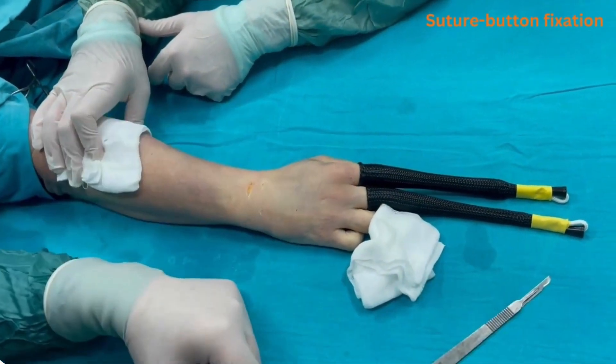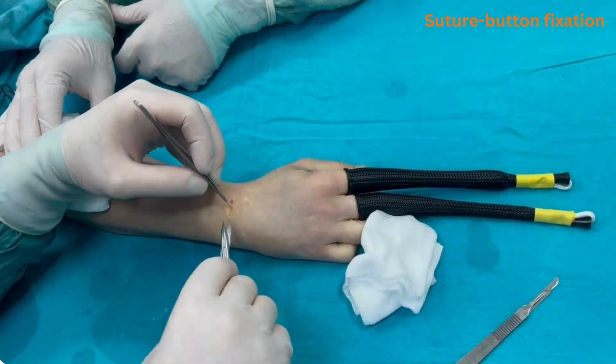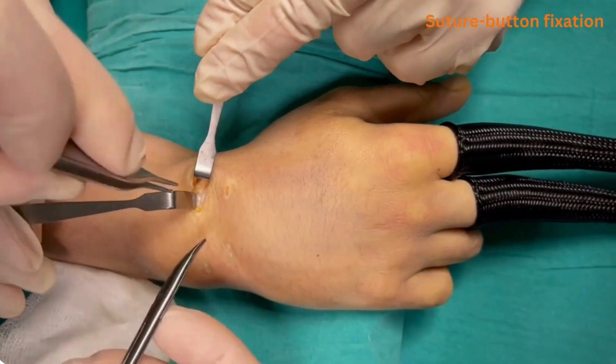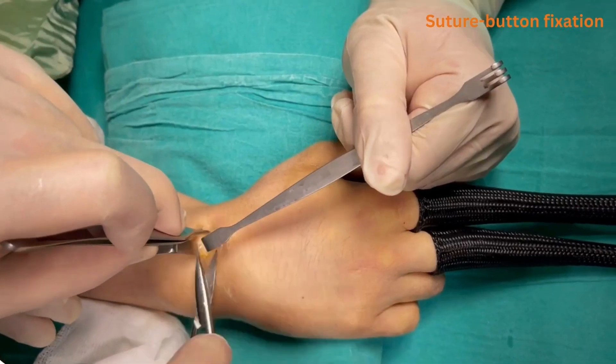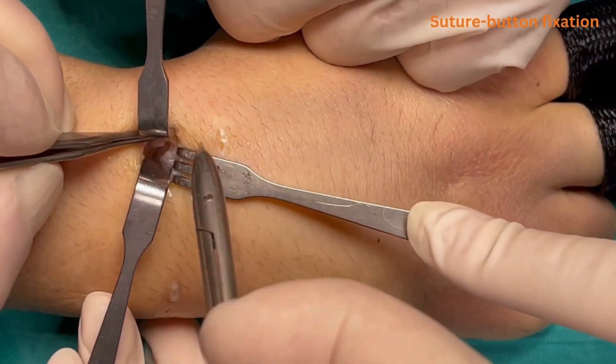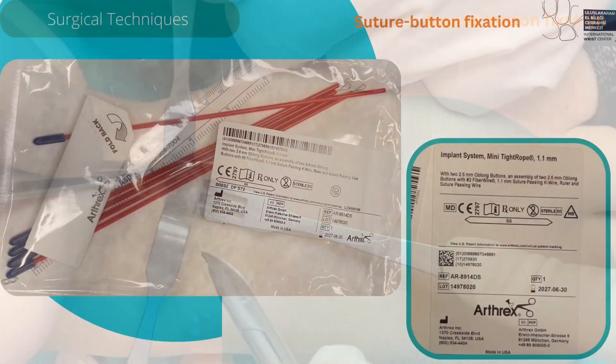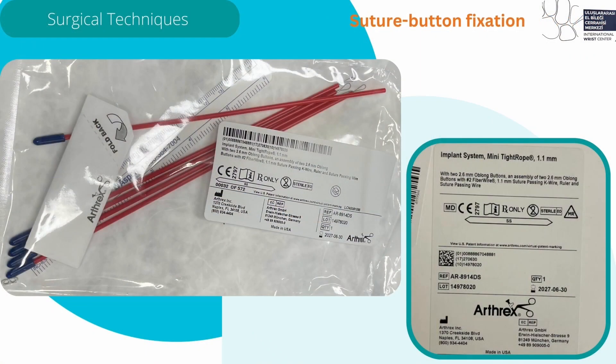Traction is released and the hand is placed on the operating table. The 3-4 portal incision is extended. The extensor tendons EPL and ECRB are retracted. Then the dorsal capsule is opened over the scapholunate ligament. We use the 2nd generation Arthrex SB system.